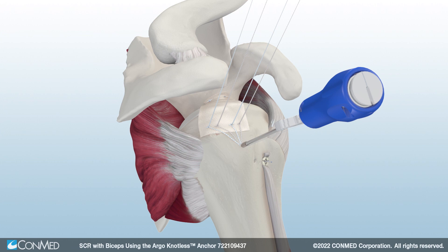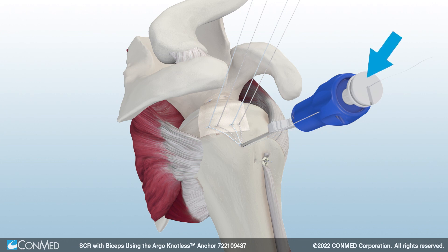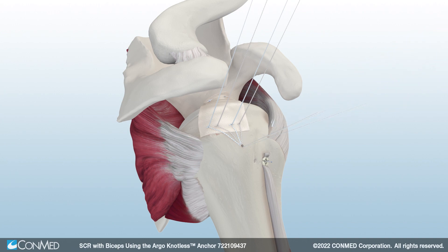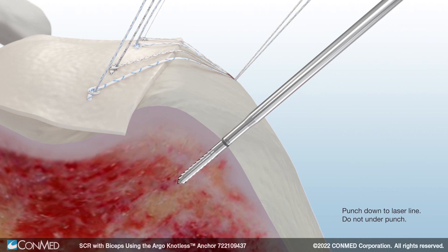While holding the white suture cleat stationary, turn the blue handle clockwise to insert the anchor to the depth mark. Then, uncleat the sutures from the white suture cleat and also uncleat the 1mm Hi-Fi retention ribbon on the back of the blue handle. Then, simply press the quick release driver button on the back of the blue handle and pull back to remove the driver handle. Next, insert a second Argo Knotless broaching punch and anchor.